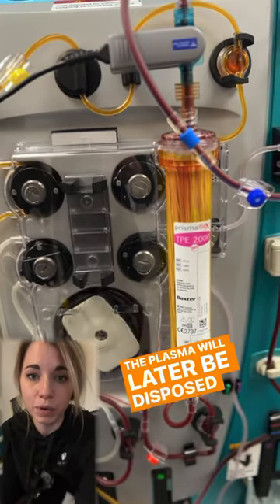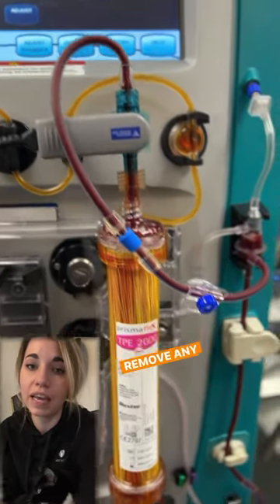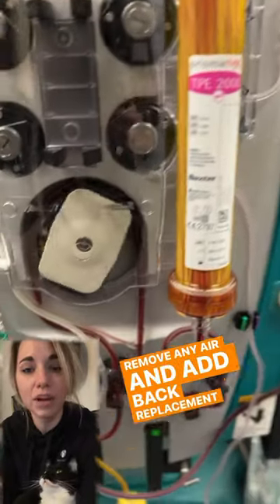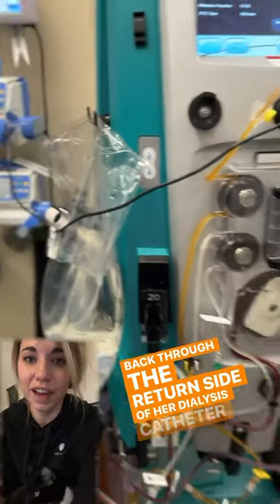The plasma will later be disposed of. The blood then moves past the air collection chamber where we remove any air and add back replacement colloids, and then back through the return side of her dialysis catheter back to the patient.